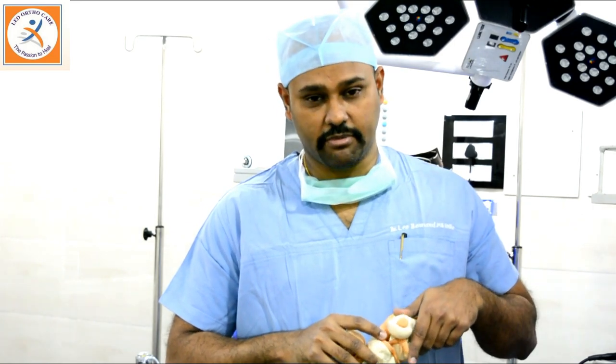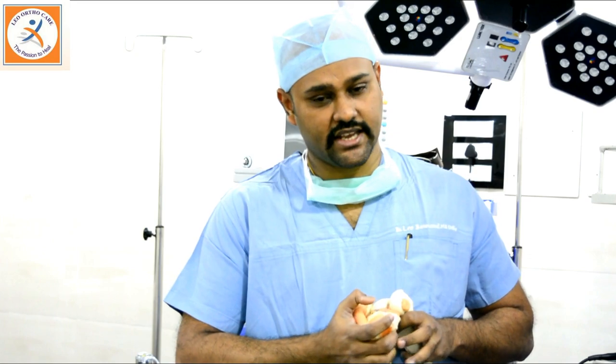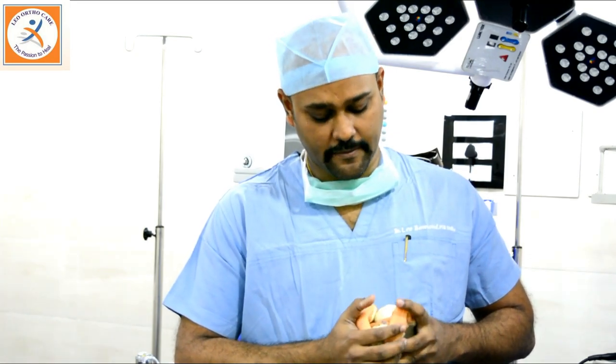Patients who are suffering from either a meniscus tear or an ACL tear — ACL is the anterior cruciate ligament — can be treated successfully with arthroscopy.